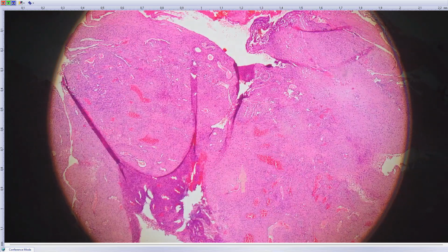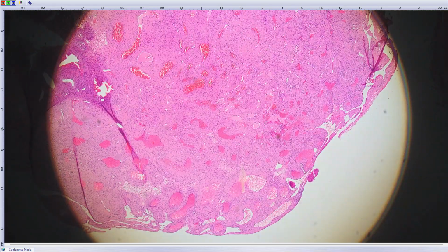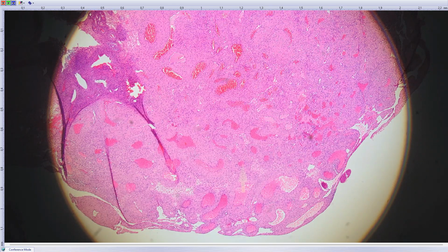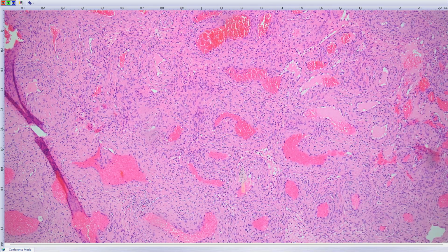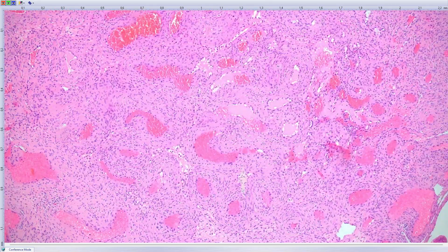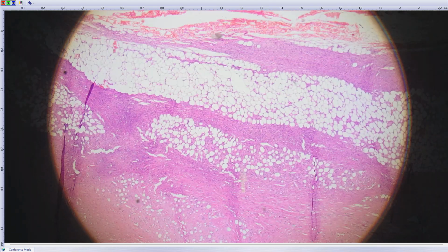So basically myofibroma / myopericytoma, and they are in the section on pericytic tumors. So again, perivascular arrangement, concentric arrangement, myoid appearing, something smooth muscle-ish, eosinophilic appearance, SMA positivity. So myopericytoma. Next case was an 88-year-old female with a tumor on her face, skin excision.